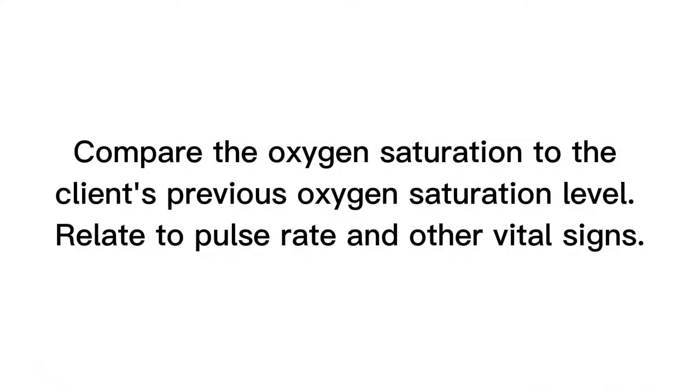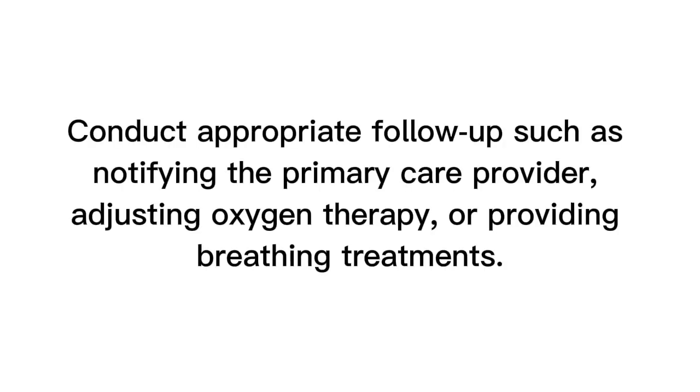Evaluation. Compare the oxygen saturation to the client's previous oxygen saturation level. Relate to pulse rate and other vital signs. Conduct appropriate follow-up such as notifying the primary care provider, adjusting oxygen therapy, or providing breathing treatment.